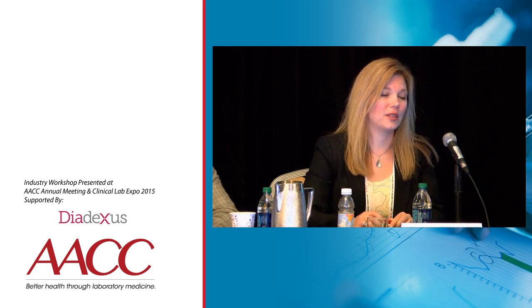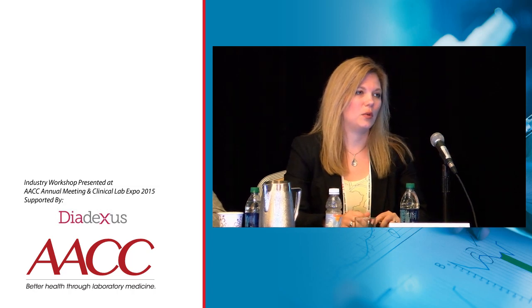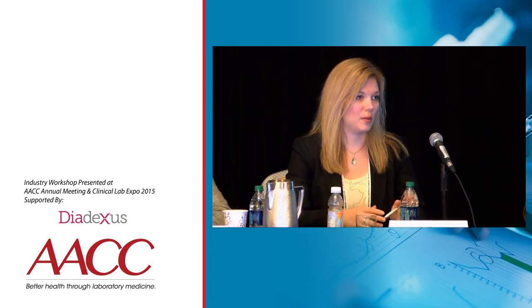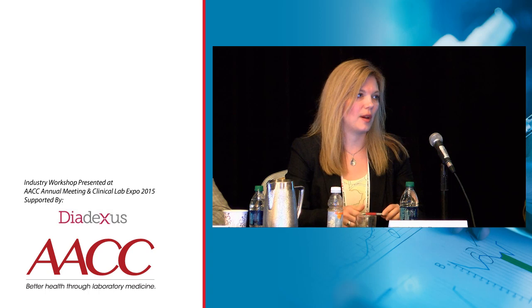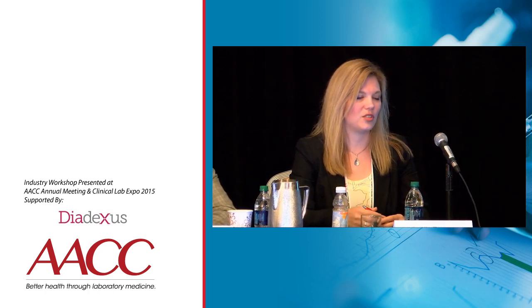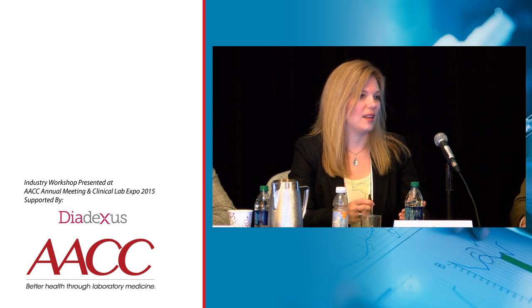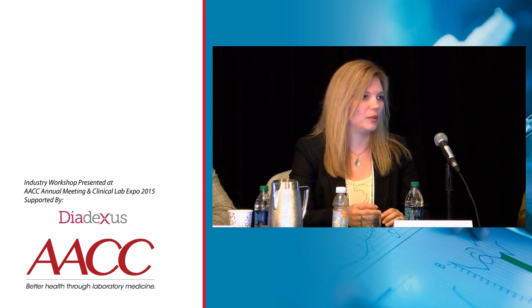We don't have the data set to look at that for follow-up. It's something that we're actually very interested in. But what I can tell you is that the issue that I showed you about the analytical stability of the test results in the concentration assay just puts at a disadvantage the tests that have been performed on samples that are tested immediately. So just because of this, in theory, we think that the activity will be more predictive, but again, we would need to look at that.